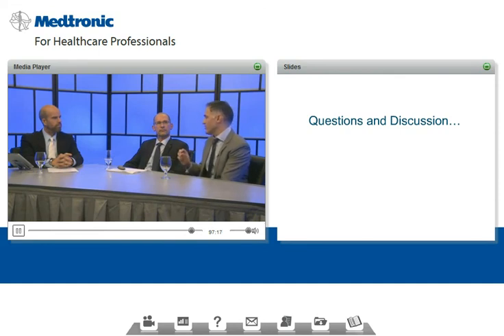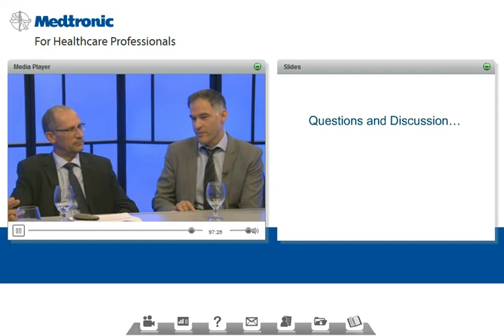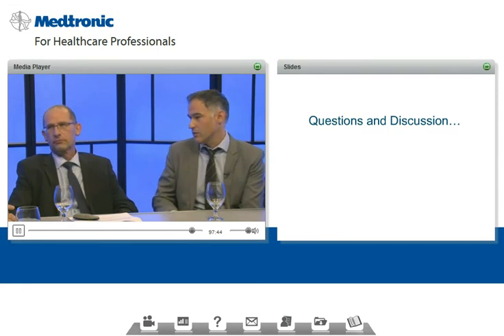If someone has 3.9 frequently, that's actually, frankly, not hypoglycemia. Our targets are 3.9 to 7, generally before meals and at bedtime for the non-pregnant adult. So I don't know how to answer that as a percentage. I don't use a percentage as an unacceptable threshold of lows. For me, it's whether they're manageable and allow daily functioning, and that they're not troublesome lows.